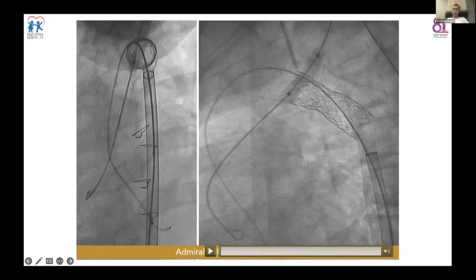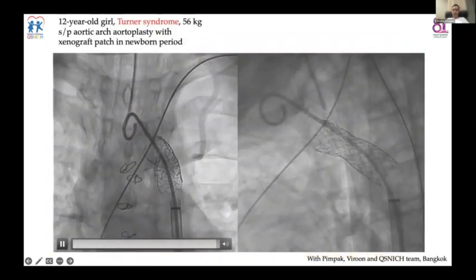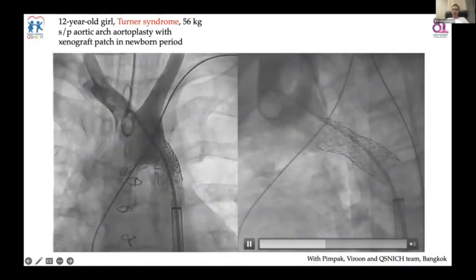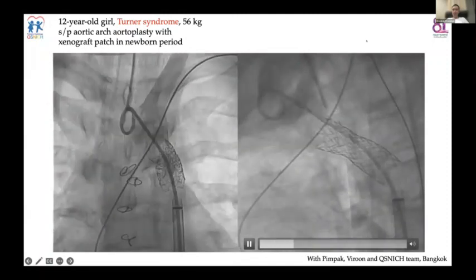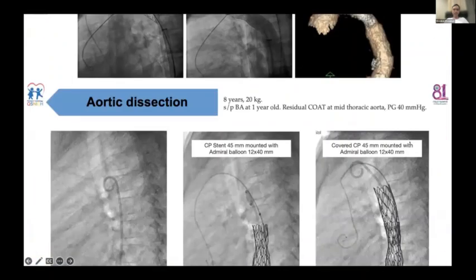We didn't want to destroy the stent here, because you can see it's very close to the distal part of the stent. So we didn't try to make that hole bigger than that. And this is the final result. Sorry for it not being very clear, showing the patency immediately. But echo-wise it looks fine, and also from the CT imaging 1 month post, it looks as if we got very good flow to the subclavian artery on the left side.